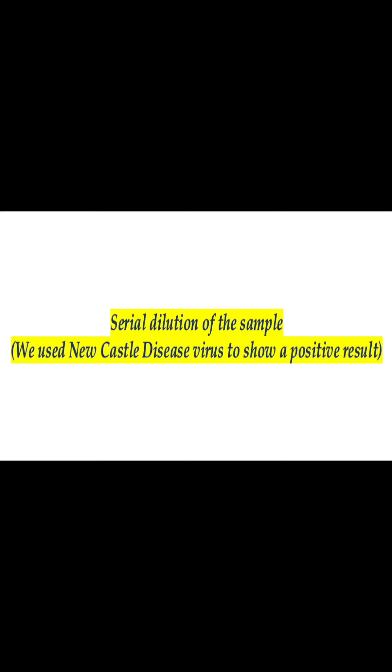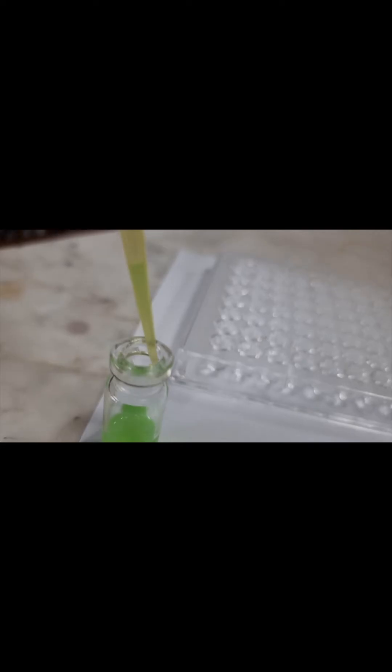Then we have to perform a two-fold dilution of the sample. For this test, we used Newcastle disease virus. First, we'll take 50 microliters of the sample in the first well and mix it thoroughly.